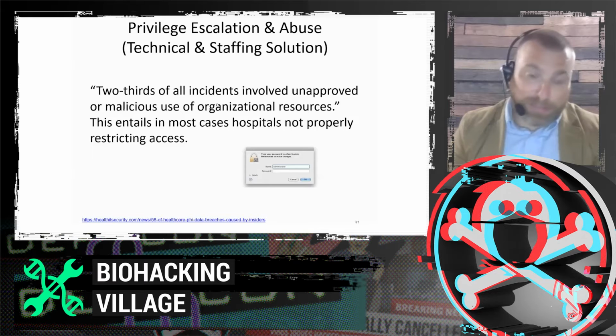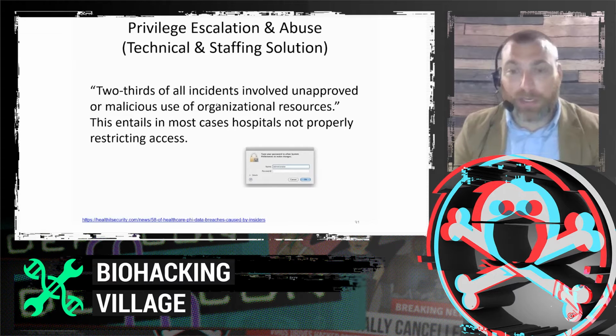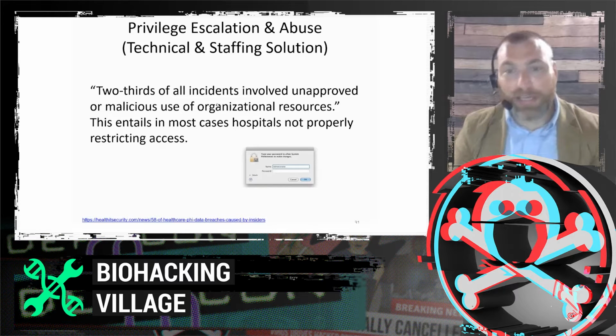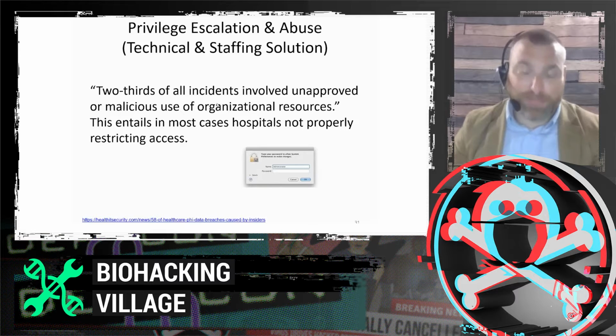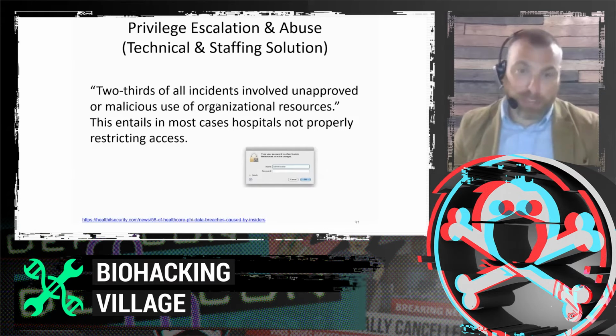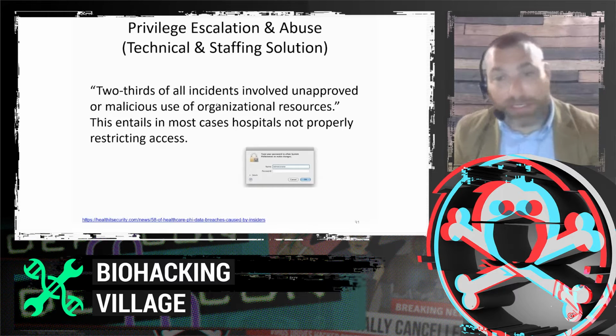But in my case anyway, it was certainly noted that the application support staff were working on call on the weekends, and they were not being paid to work on call. So if you're doing that, you're basically creating a situation that encourages or incentivizes your IT staff to leave access more broadly open than it probably needs to be, so that they're not getting a call at 11 o'clock at night during shift change when new nurses come on, maybe temporary nurses that need access.